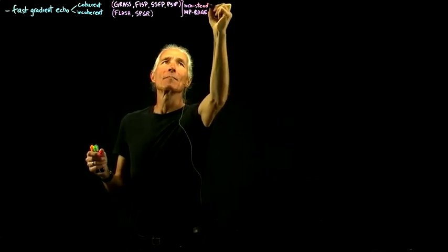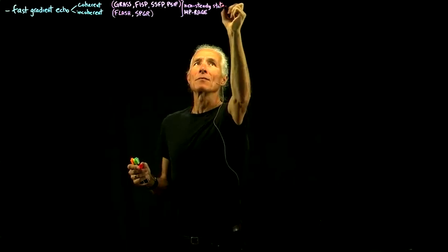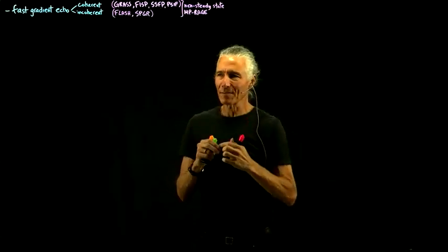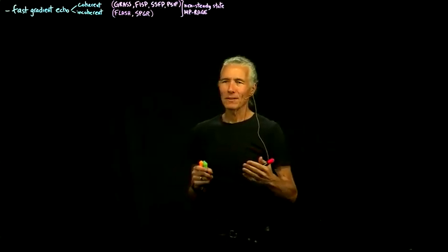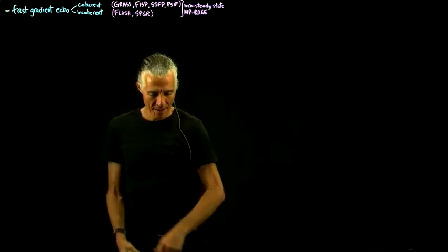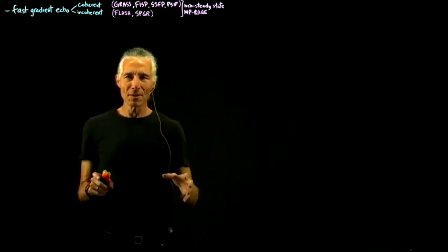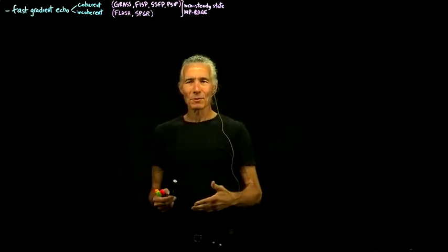This is probably one of the most common structural scans that we use at the MRI center, and it's used all around for basic gray-white contrast, just to make something that looks like what you think of as a brain, with the white matter lighter than the gray matter. So we'll build up to that one, but we'll start with the coherent ones.